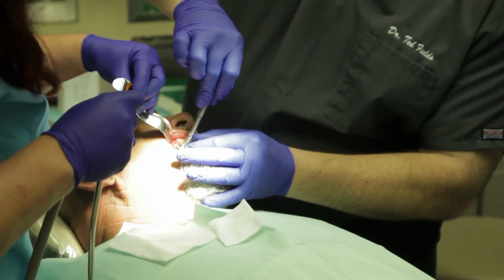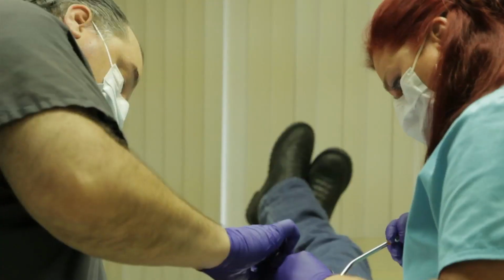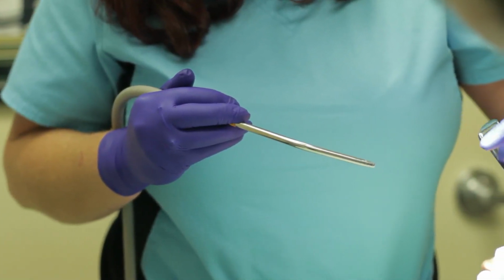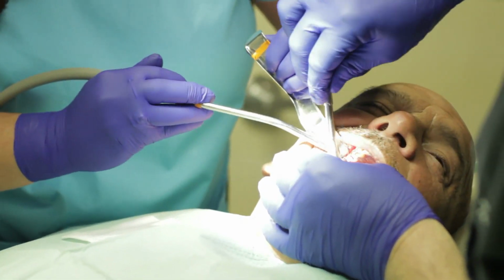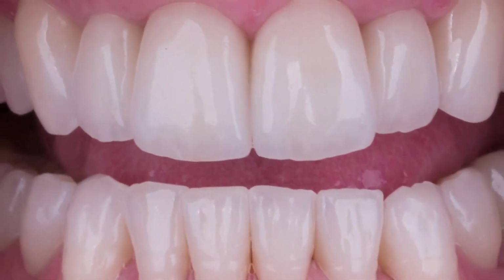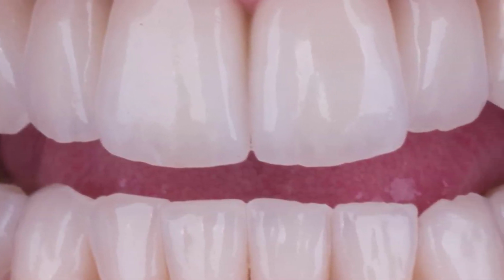One of the big advantages of zirconia as an implant material is plaque adhesion, and bacterial adhesion is less than many other materials that we use in dentistry, and this allows a healthy soft tissue response, minimizes inflammation, and gives us long-term healthy aesthetic soft tissue. They look really nice and they support long-term oral health. It's the first material that I've seen in oral surgery where we actually have patients requesting a specific material.